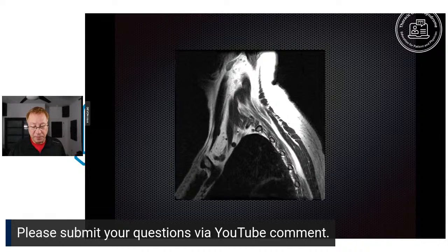Just another example of MRI. The fat is white or light gray. The muscles are medium to dark gray. The brachial plexus is a lighter gray. Can separate it out beautifully. We can see the bones in this case. We even see subclavian artery and vein without contrast.